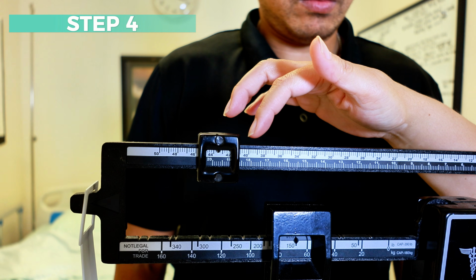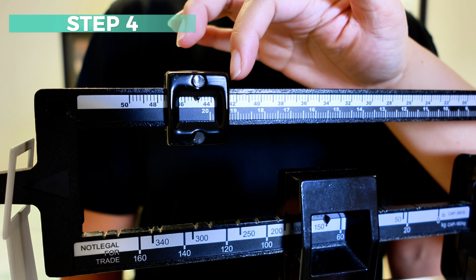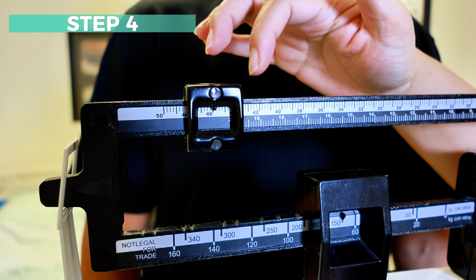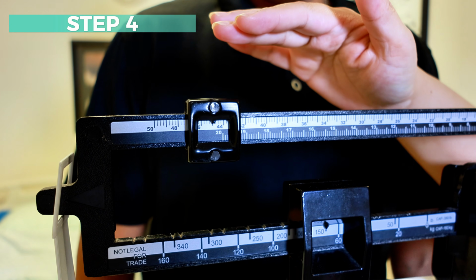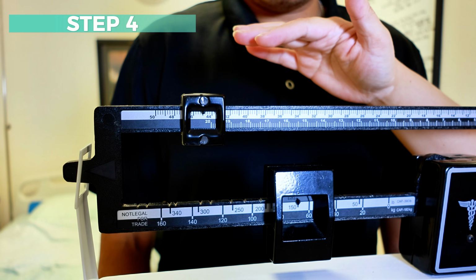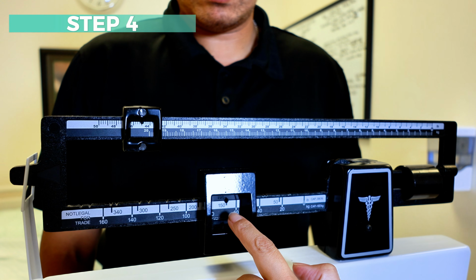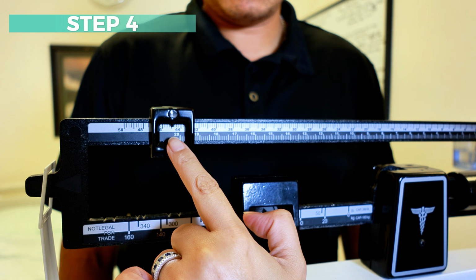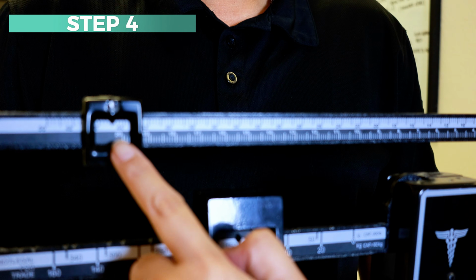Oh, there you go. Starting to go down. So let's move it a little bit more. That's too much. Okay, I see it right there. Okay, so you weigh 150 plus 45, right? So that would be 150 plus 45 is 195.